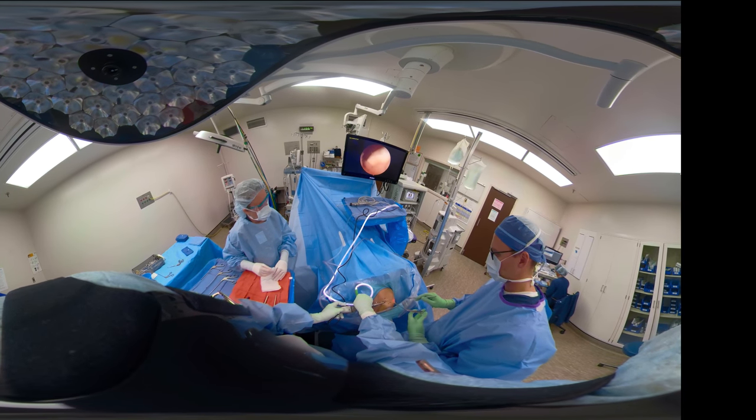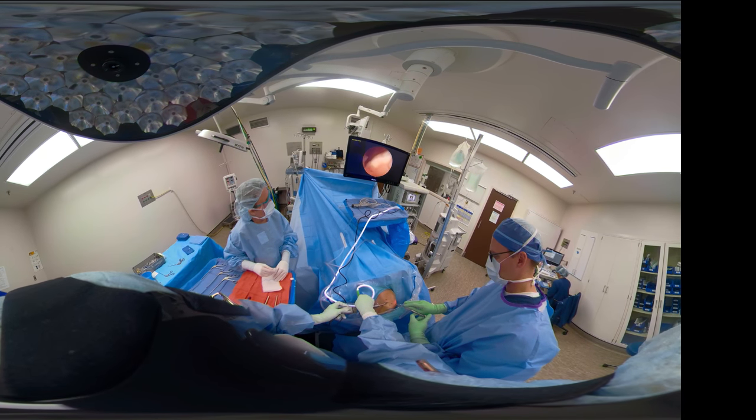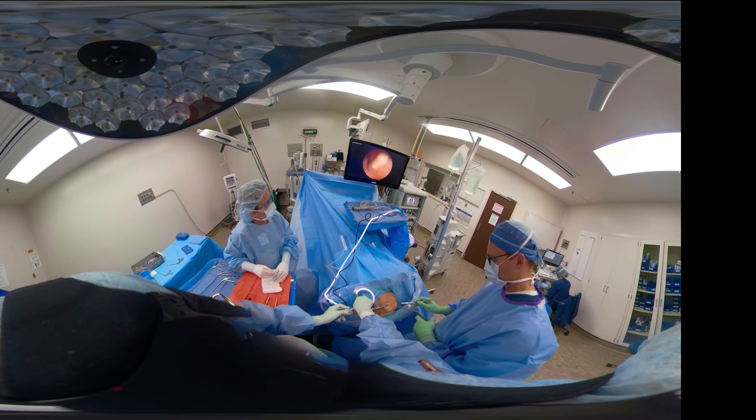So he's looking down at the portal, looking up at the screen, and it is important to have the screen directly in the middle of the patient or in a position that is easy for you to manipulate your eyes and your neck.